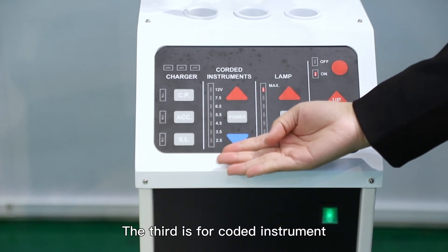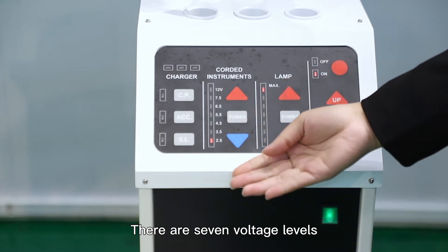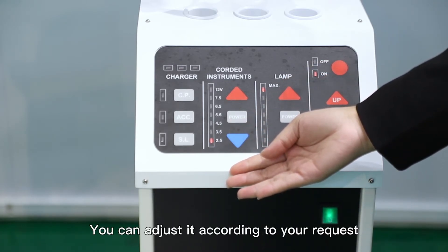The third is for the corded instrument — power on. There are seven voltage levels. You can adjust it according to your requirements.